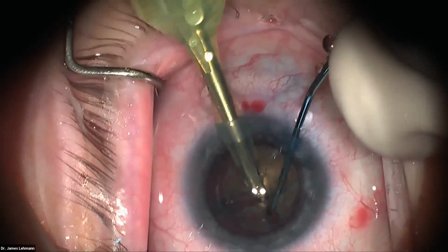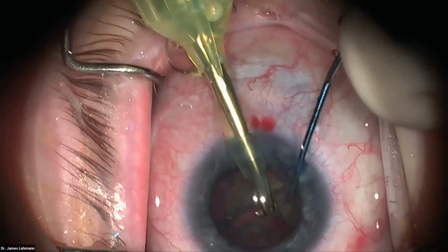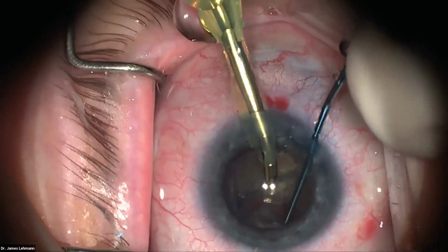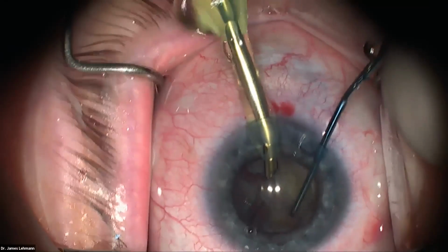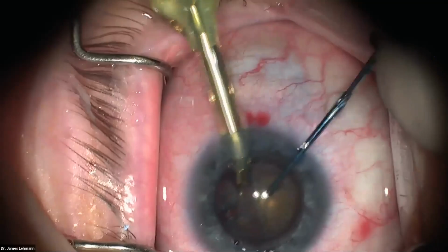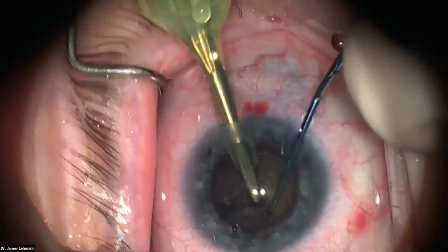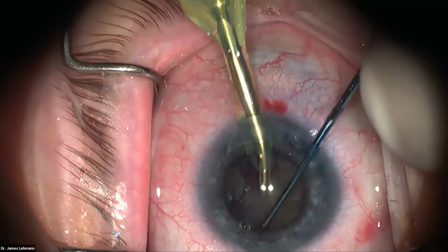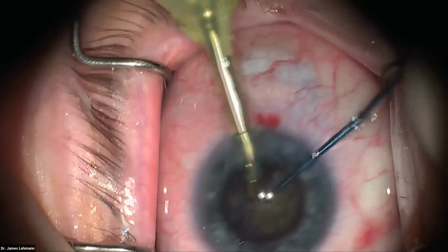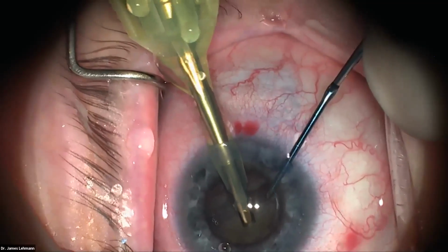And for purposes of this video, trying to keep everything pretty straightforward, I'm going to go ahead and break up all the quadrants, but sometimes you can go ahead and take that first quadrant out, especially if the lens is not rotating so great. And taking that first one out can create space and also remove some epinucleus. So you can see here, I didn't have to crack it anymore or groove anymore. And then we just have this heminucleus here that I'm going to sculpt a little bit.